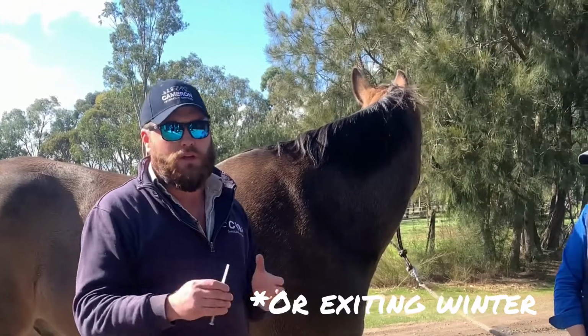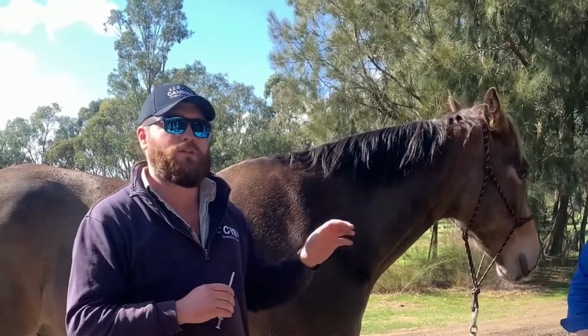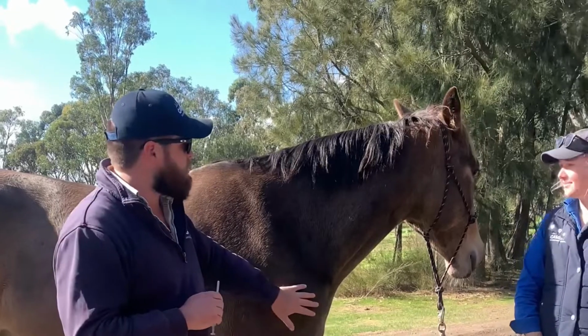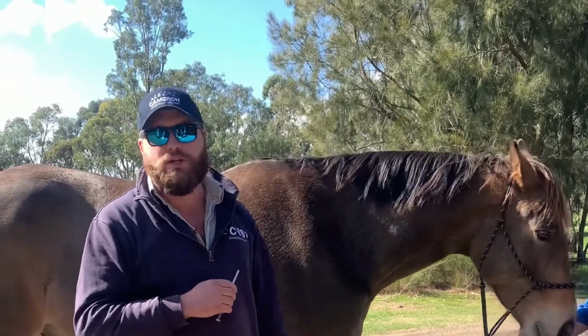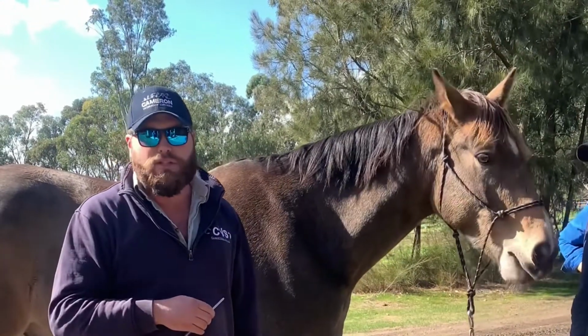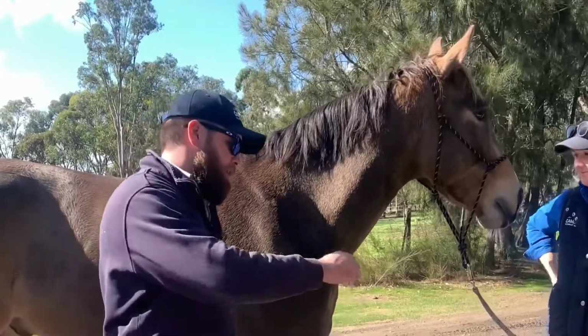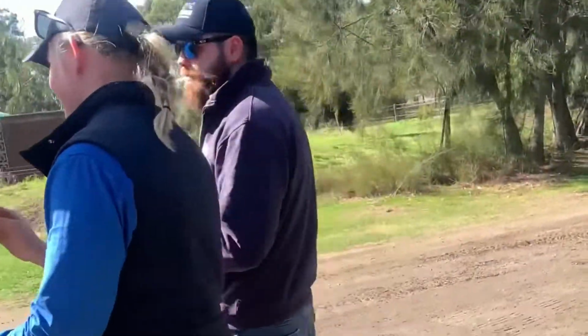Very important, as a lot of our older horses in particular start to lose weight, and there can be a lot of dental conditions associated with that. This horse is a young horse, and it's a very routine examination. He was done about 12 months ago. He has had wolf teeth removed, and we're here again 12 months later to see how he's progressing. So I'm going to go around the other side and inject him because it's habit, but we'll inject him and sedate him and go from there.